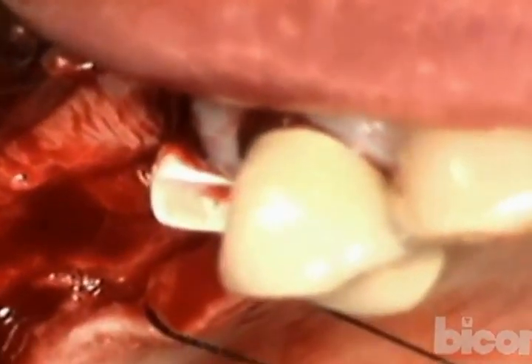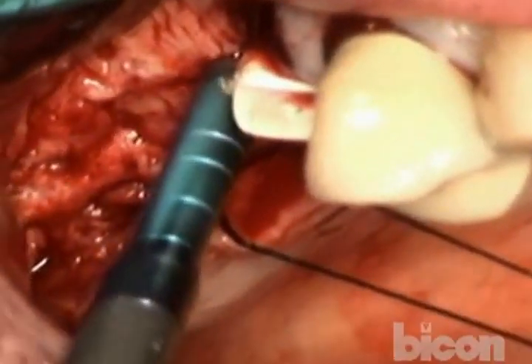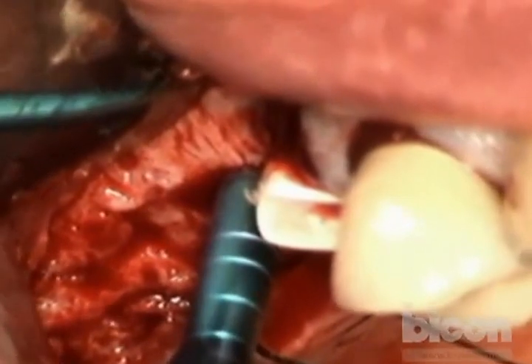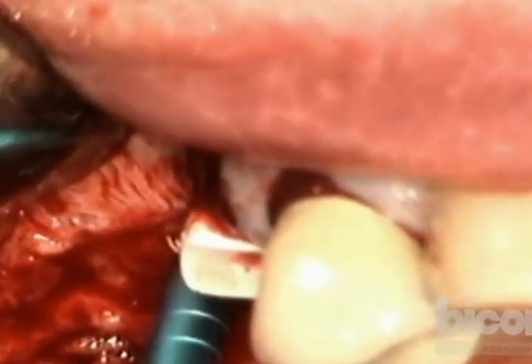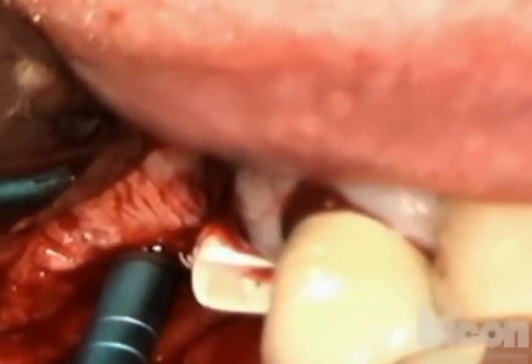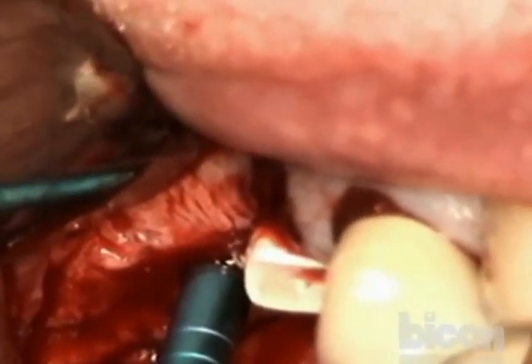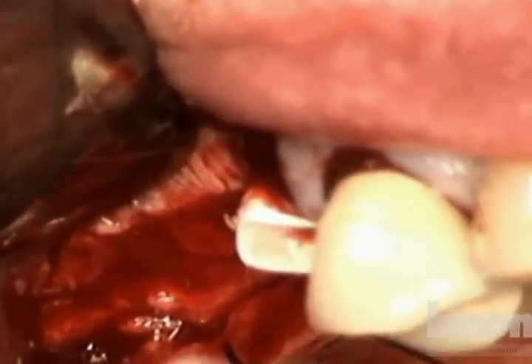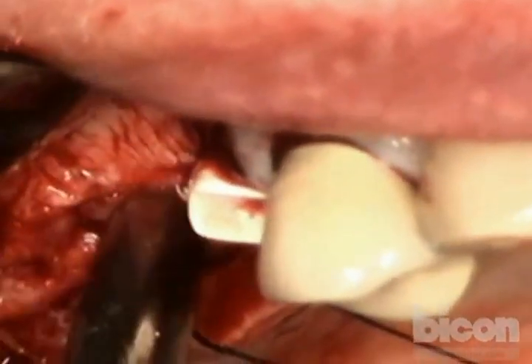Now the question always comes up, why don't we use piezo surgery, for instance? Because I think this preserves the bone a lot better. But it is a lot noisier, that's for sure. Our patients are great and they allow us to do this, but it's not a pleasant thing, suction. Not by any stretch of the imagination. So we will again go back to scoring.